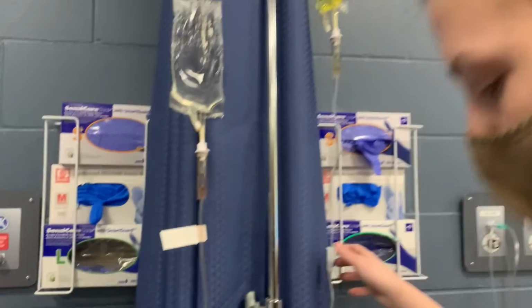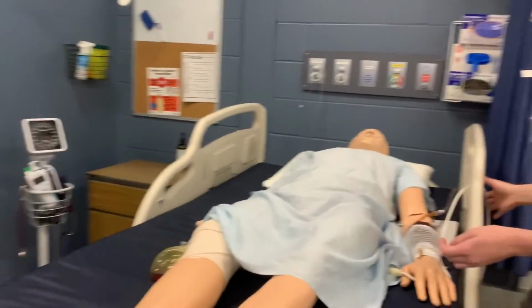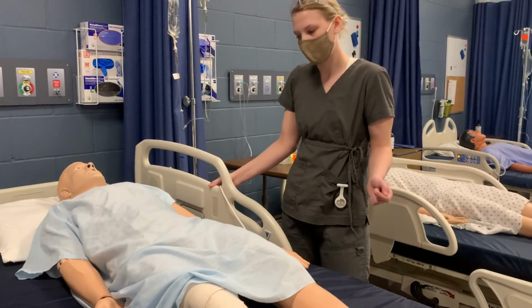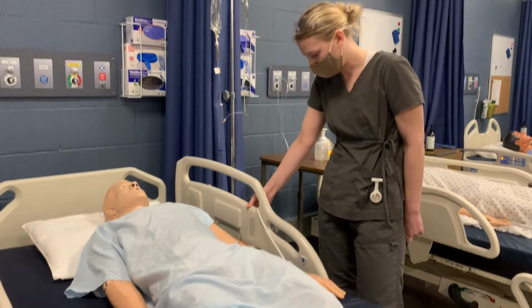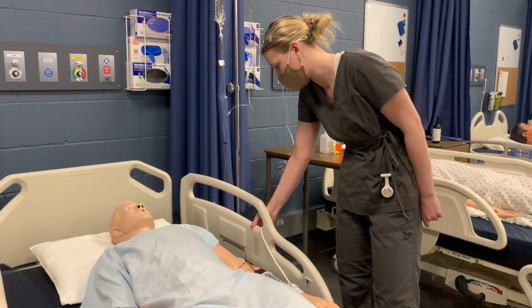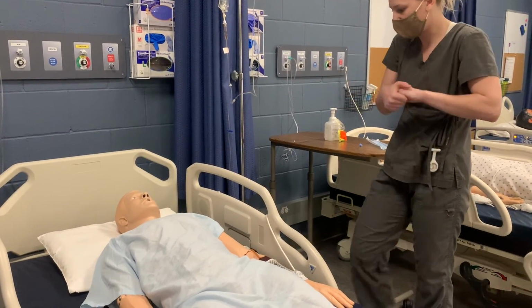And I'm just confirming with my patient here that they're feeling okay. They didn't feel funny at all while that was going in. No? Nope. Awesome. And any questions at all for me? No, thank you. I'll be coming back to check up on you throughout and make sure that you're doing okay in here. Okay. And yeah, thank you so much for allowing me to give you your IV antibiotic.